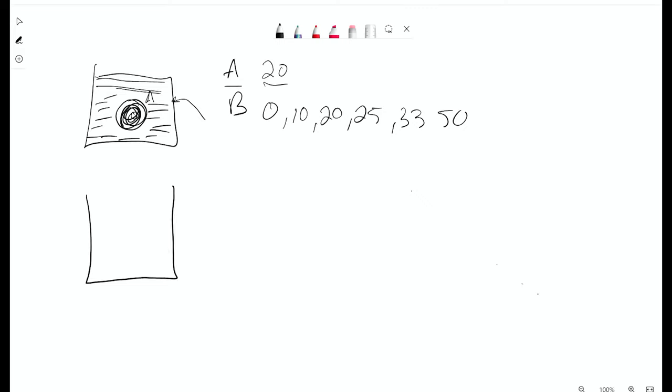So if this is the case, I start to run the sequence, and I've already run my pre. This is my pre. Okay, so my post, let's say I've selected 20. That means I need to fill 20% of the center of K-space, and then I'm also going to fill the first 20% of the periphery. So I've filled the first 20. Make sense? Yeah. So far?